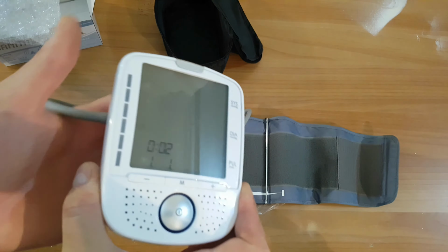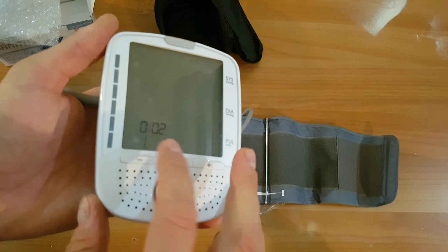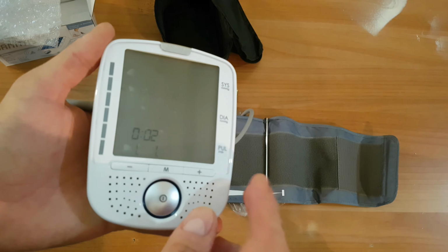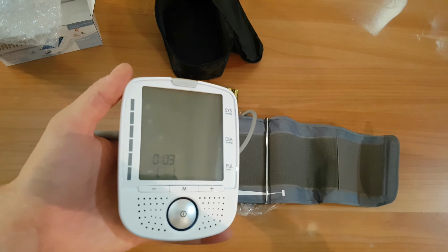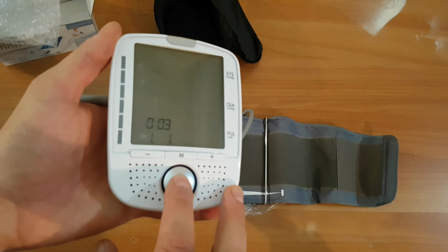Okay, already we can see we've got the time here. We can arrange the time, set up the time. Here is the start stop button.